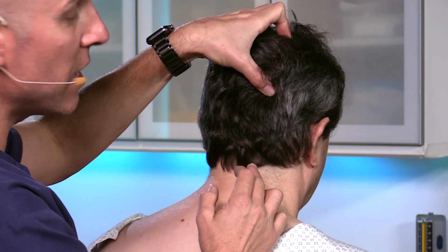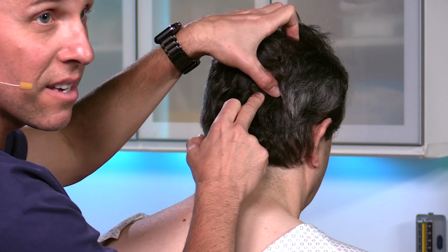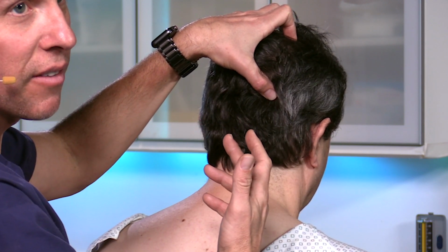You feel that artery in the same general area that you want. If you want to be a little more pinpoint and a little more precise, you just go just medial to that, making sure that you're not injecting into the artery, obviously.